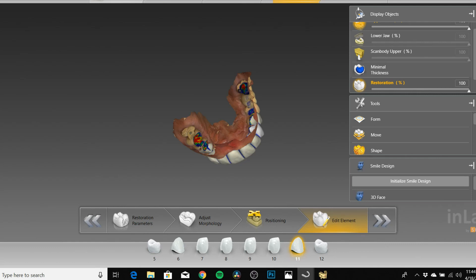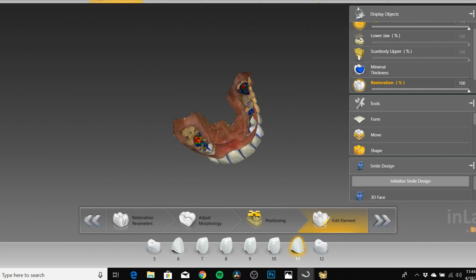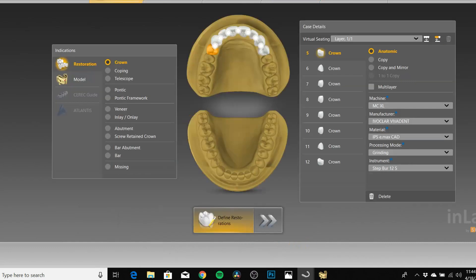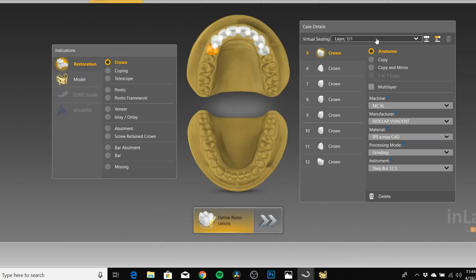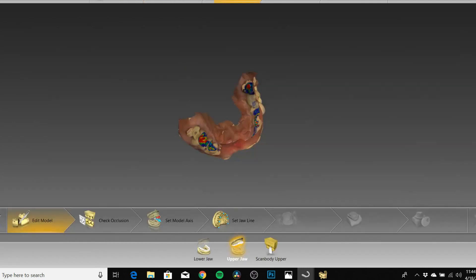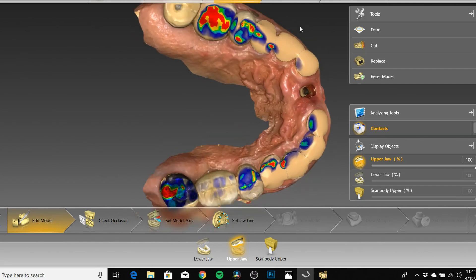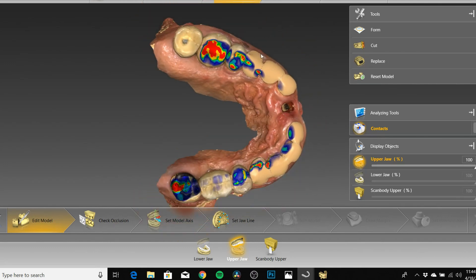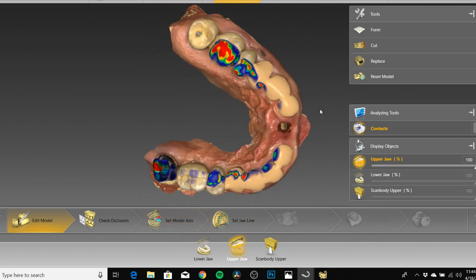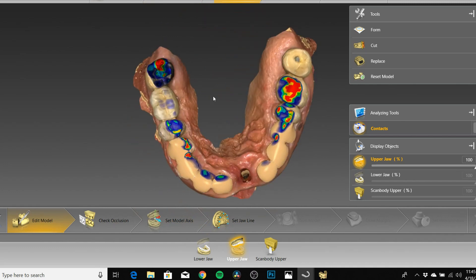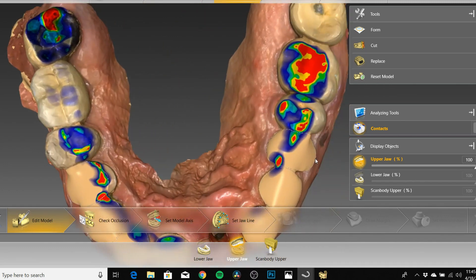At least for inLab, this is how things are done. Let's start in Administration — we've got everything marked as we would. Everything's gonna be labeled as a crown. You do your scan, and once you get to the model phase, you can see how my preps were done.